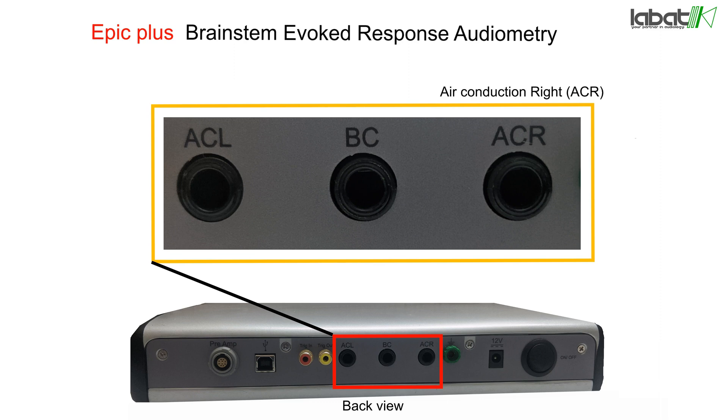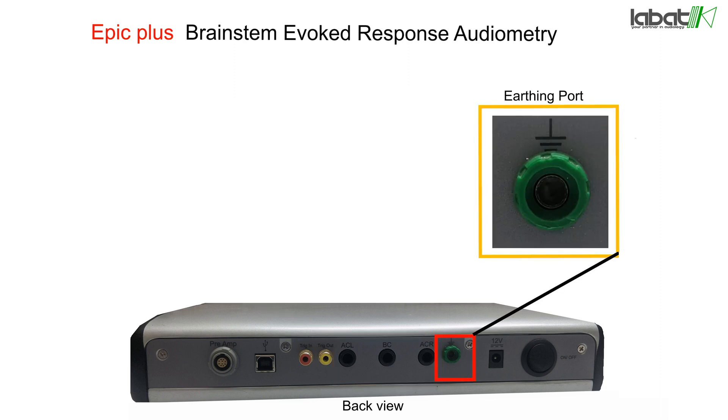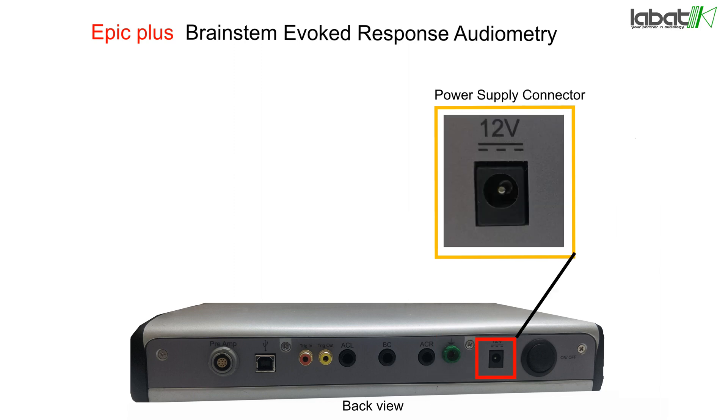Air Conduction Left (ACL) is used to connect the left ear headphone or left ear inserts. Air Conduction Right (ACR) is used to connect the right ear headphone or right ear inserts. Bone Conduction connector (BC) is used to connect the bone conductor. The earthing port is used to reduce unwanted electrical interference or artifacts with the help of proper power grounding.